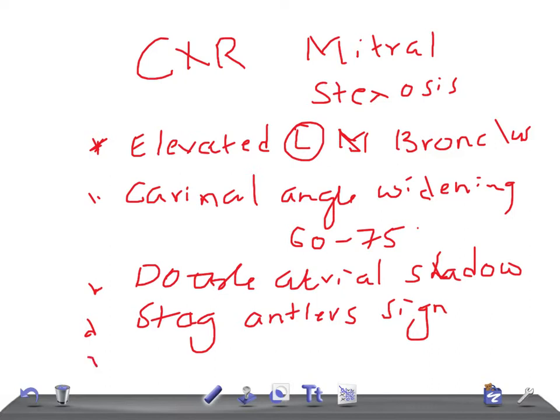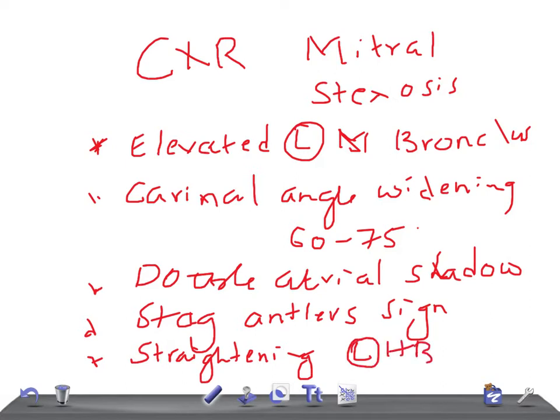Another very important finding is the straightening of the left heart border, along with a prominent left atrial appendage. A prominent left atrial appendage is very pathognomonic of rheumatic heart disease. If you do a barium swallow, you will also see impressions on the esophagus.